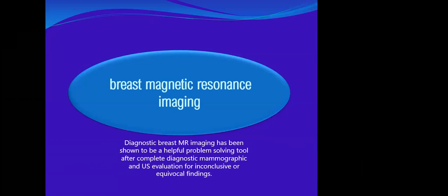Okay, what about breast magnetic resonance imaging? It has been shown to be a helpful problem-solving tool after complete diagnostic mammographic and ultrasound workup for inconclusive or equivocal lesions.